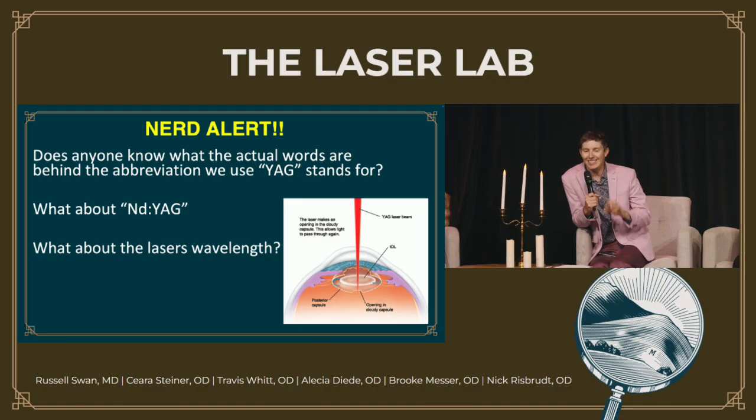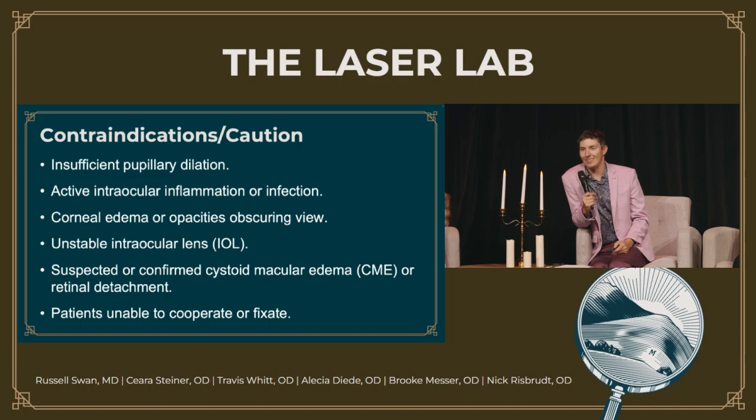And so I just say that, again, it is way, way uncommon to have an unstable lens, but it is very helpful to know their surgical history. And if they have a decentered lens or just an atypical appearing lens, it is worth a conversation with the surgeon. Because again, that's a bummer. This was like the nicest guy ever, and he's so happy that I put a secondary IOL and got him his vision back. And I was like, well, that's very nice of you. That was excellent. But don't advise that, for what it's worth.